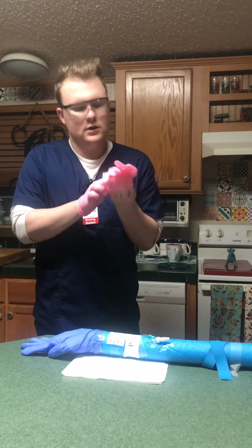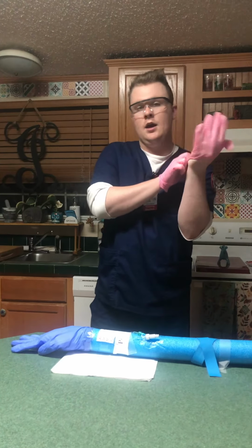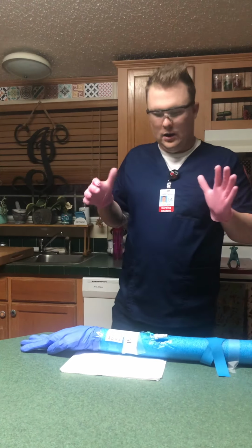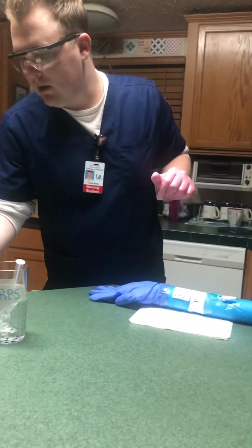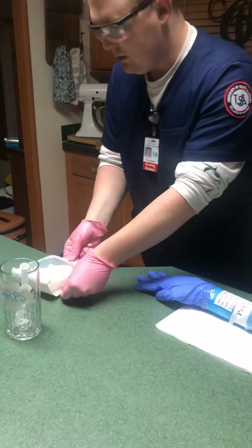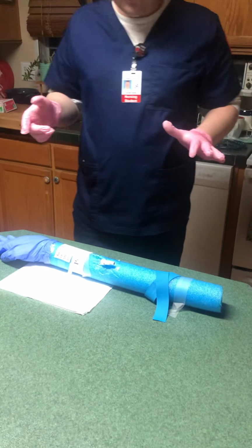Okay. So now that I've donned my clean gloves, I would already explain the procedure to my patient and have the bed in the correct position that I need. So now I have with me right here some sterile gauzes. I'm just going to have it just like this, and I have some tape already prepared.